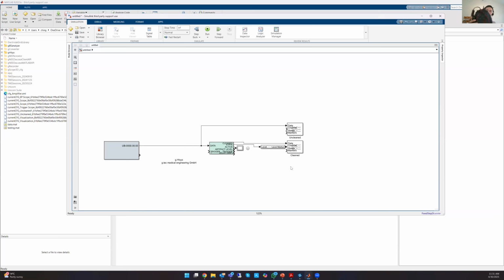Okay, then we'll mount the cap. Give me a second. Before I mount the cap, there are two open strands, as you can see here. One is reference, one is ground. I need to attach the mastoid sticker.